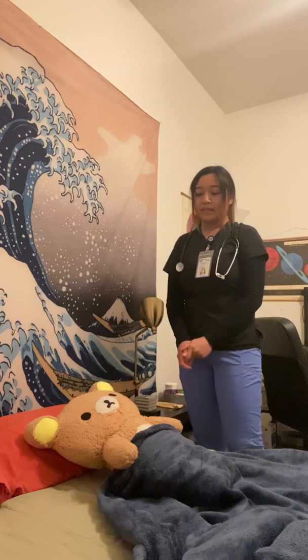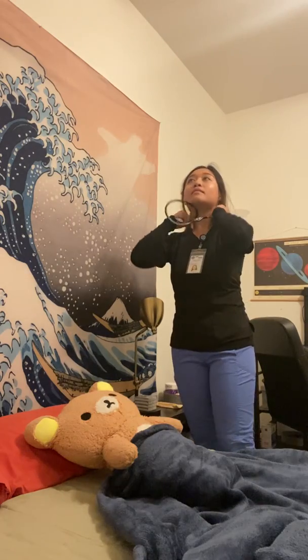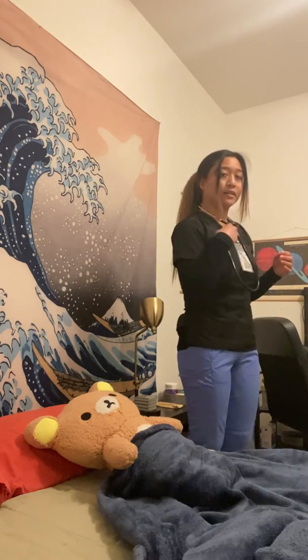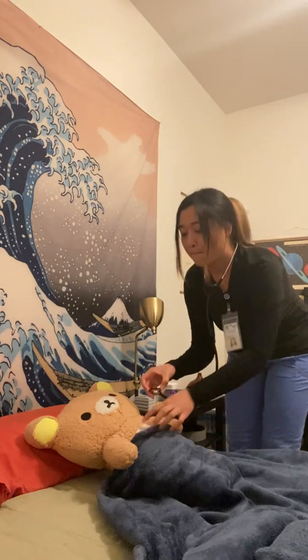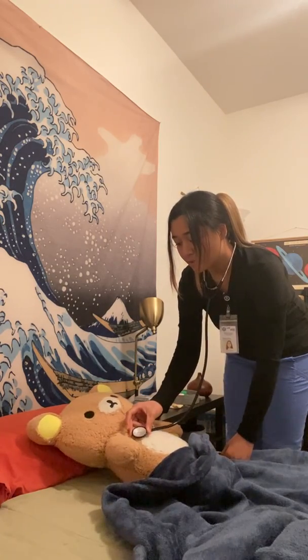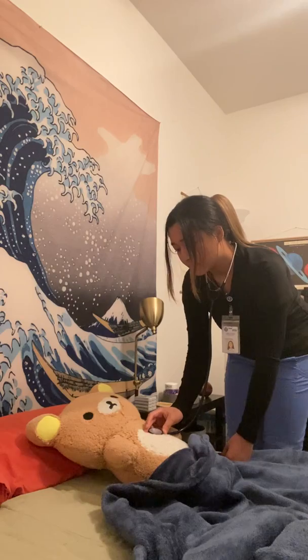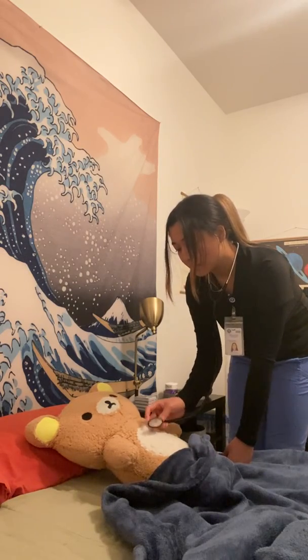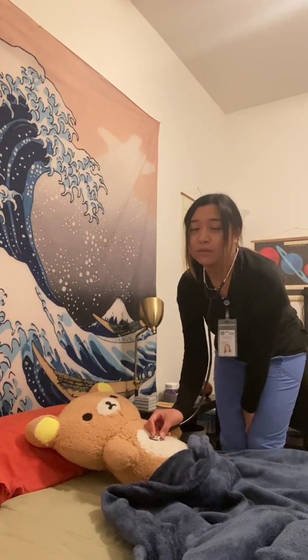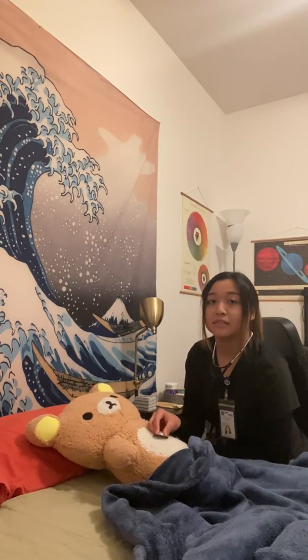And now I'm going to be assessing the heart. So I'm getting my stethoscope. I'm going to look for the aortic, which is on the right side, my right. So I'll be using the bell for this. The right side right here. And then pulmonary valve, tricuspid, and then for the mitral, I'll be using the diaphragm for that. And I would be listening for the apical pulse for 1 full minute. I have a clock over there, so I'm going to be using that starting now.